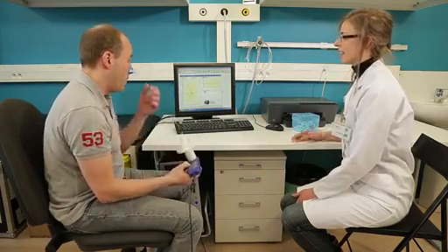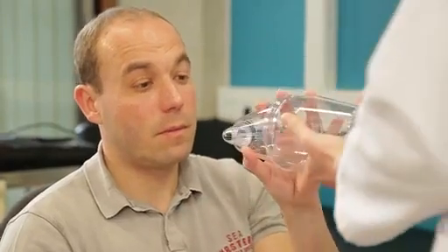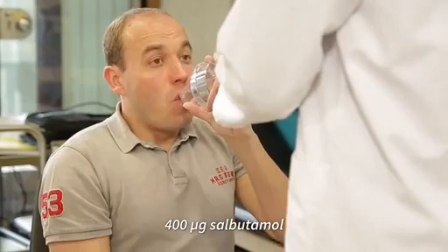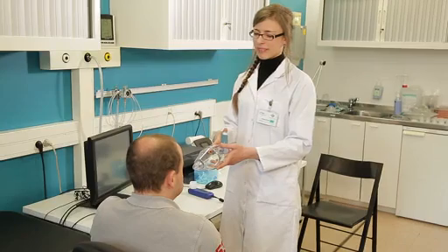So we first perform a spirometry, then we give the patients bronchodilators. We usually give 400 micrograms of salbutamol to maximally open the airways of the patients and also to prevent bronchospasm that may occur during the induction phase.